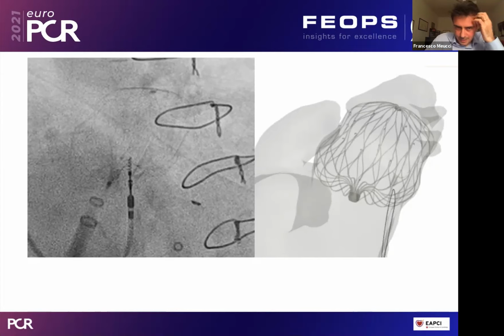Nowadays it's something new, but in the future we will send a CT scan and we will have back an answer like the one we solved today, a more complete and easier way of reading the CT scan. So thank you so much. Of course, I'm very happy with this.